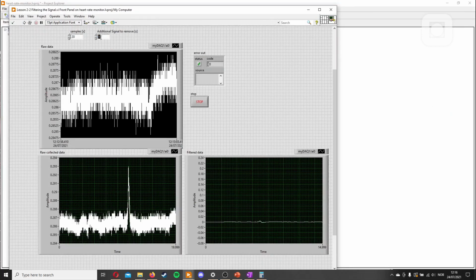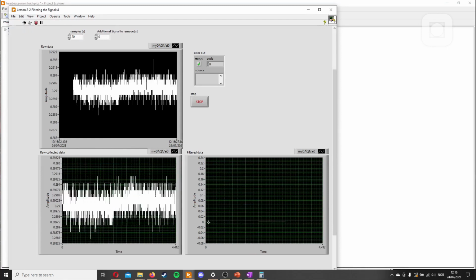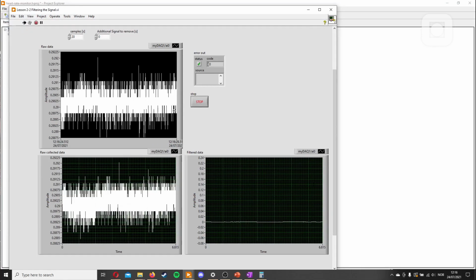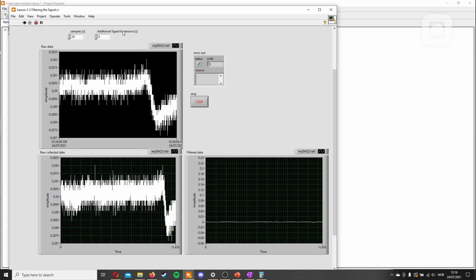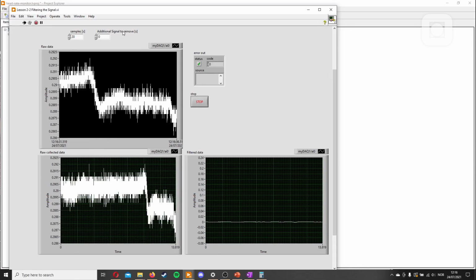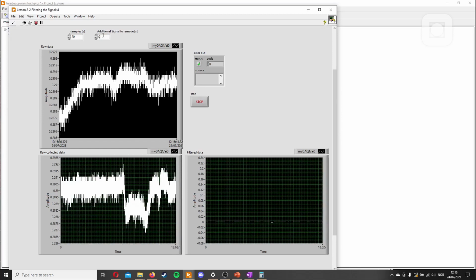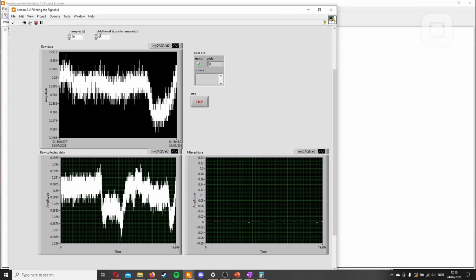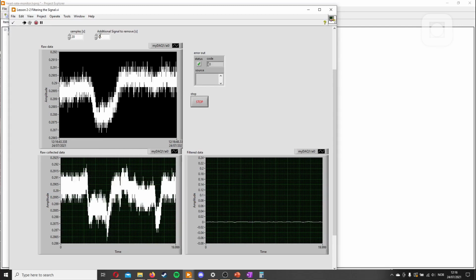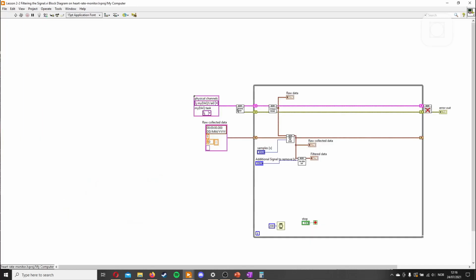Okay, so let's start again. Let's set this one to 0 now so we can see the whole signal. So as we see, we don't have the start anymore. We don't actually need the remove additional signal, but sometimes we can get this noise anyway. But as you see, without removing any part of the signal, we have a nice clean waveform. And it's still the exact same waveform because we just added the extra part and used that to stabilize the filter, and then we removed it again after it had filtered.